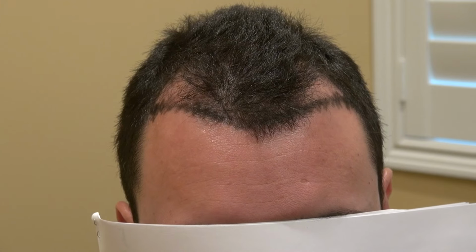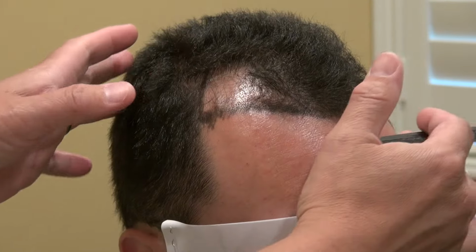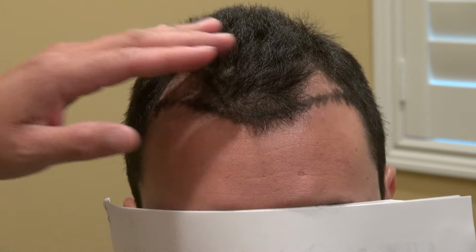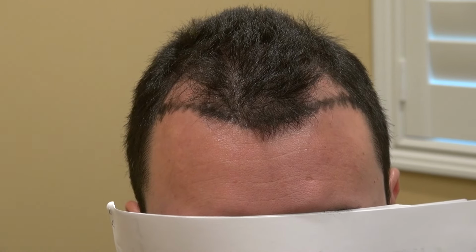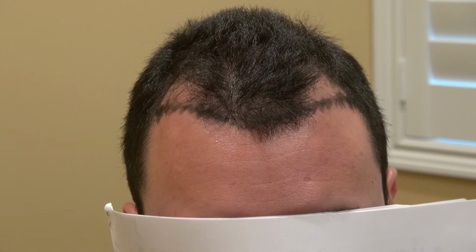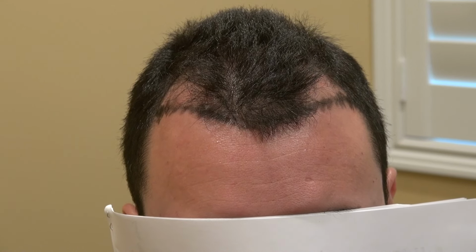So this is the art of hair transplant restoration surgery on a client with thinning in both corners. We'll be attempting using the FUE method, and FUE, as you know, is the most advanced technology available. It leaves you tiny dots of scar scattered through the back like a mosaic pattern, allowing you to wear your hair shorter. And I'll be the surgeon who will personally design your hairline, personally extracting hair one graft at a time. That will give you the best, healthiest grafts and best density, and making precise angles.